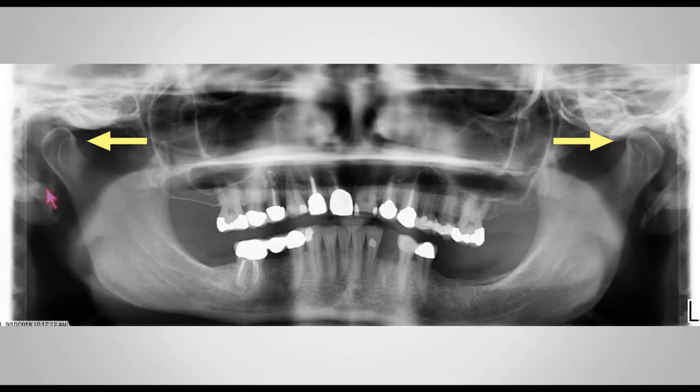And again, if we fabricate an orthopedic appliance, which is a splint, regardless of the material or the technique that you use, the whole purpose of an orthopedic appliance is to help you stabilize not only the teeth, but most importantly, where the system starts or where the system works, which is actually up here in both glenoid fossas. It's up here in the TMJs. This is the area where all this system works. So you got to make sure that this is healthy before you do anything major in this occlusion. And I think that we'd all agree on that.